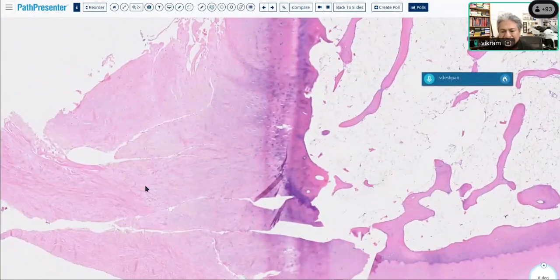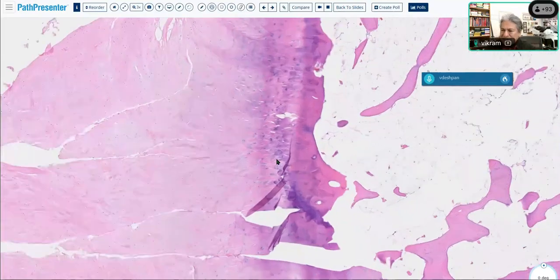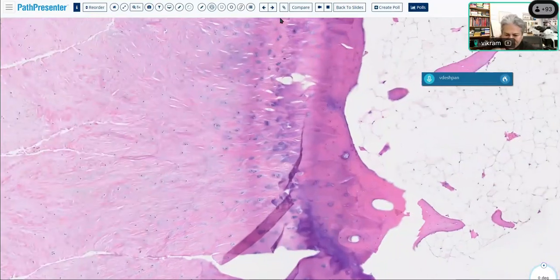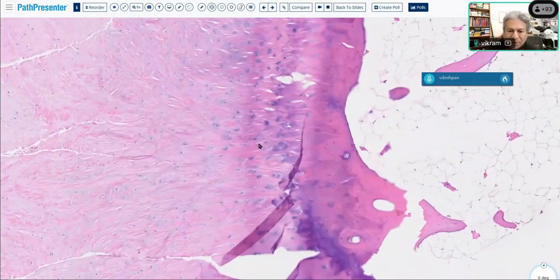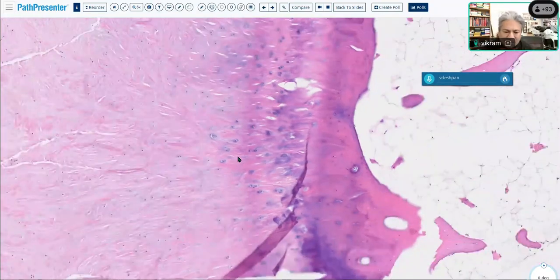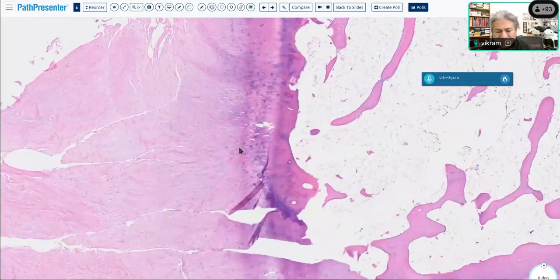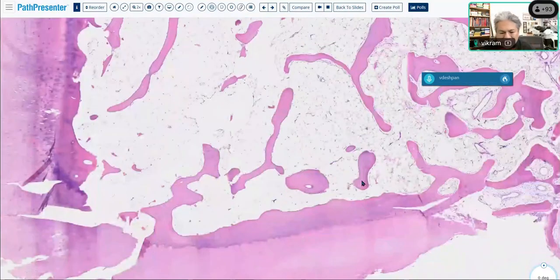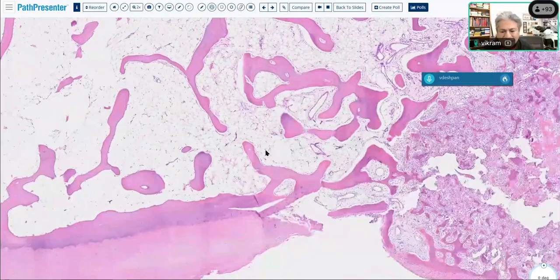So this is a tendinoligamentous insertion site. So when tendons insert into the bone, the tendon has to go and attach to the bone. That interface of the tendon attaching to the bone is composed of fibrocartilage. So this is typical fibrocartilage, right? This is not hyaline cartilage. And you'll see this very, very frequently. And this, of course, is more prominent because there's a lot of degenerative change as well, in an older individual. Okay, so articular hyaline cartilage, your tide mark, and this is the lesion.